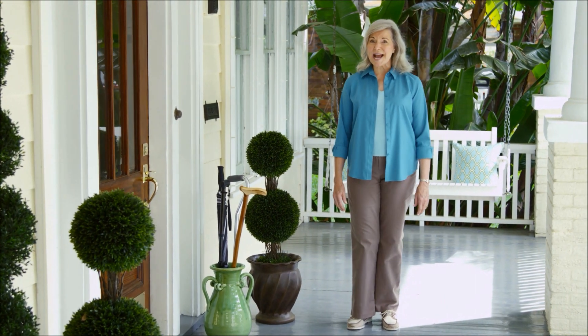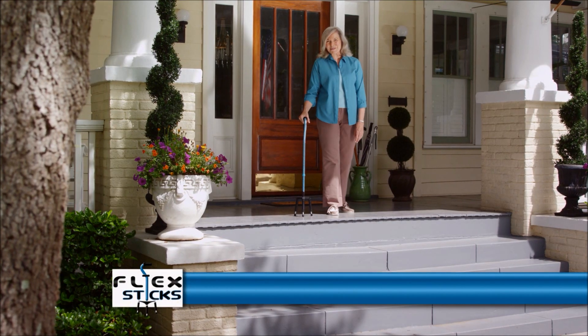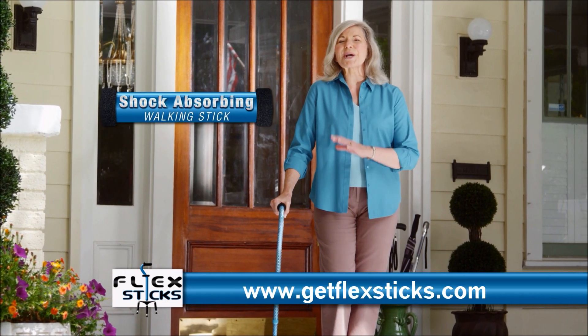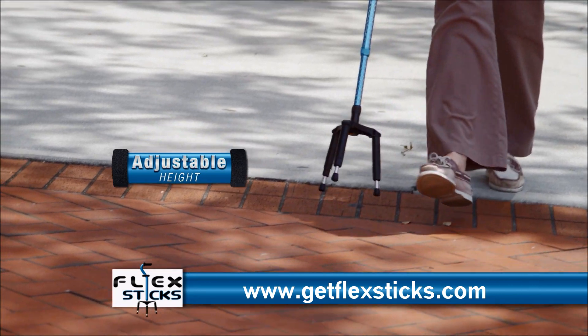If you're like me, you want to stay active, but these old-style canes just left me feeling unstable and not very confident. Then I heard about FlexStick, the shock-absorbing walking stick that allows me to go anywhere I want to go with complete peace of mind.